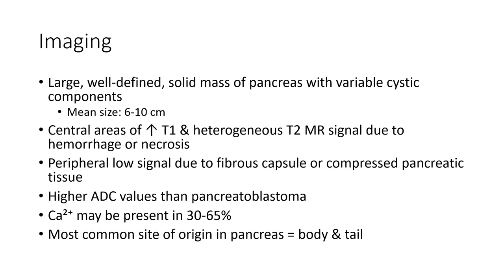On imaging, it appears as a large, well-defined solid mass of the pancreas with variable cystic components, with a mean size of 6-10 cm. There is a central area of increased T1 and heterogeneous T2 MR signal due to hemorrhage or necrosis. Peripheral low signal is due to a fibrous capsule or compressed pancreatic tissue, with higher ADC value than pancreatoblastoma. Calcification may be present in 30-65%, and the most common site of origin in the pancreas includes the body and tail.